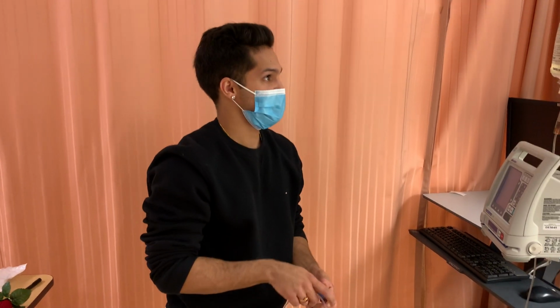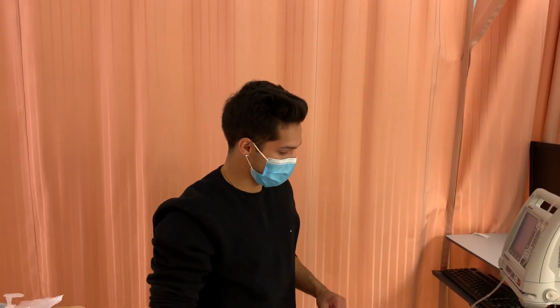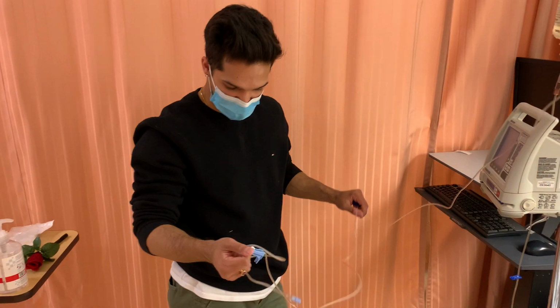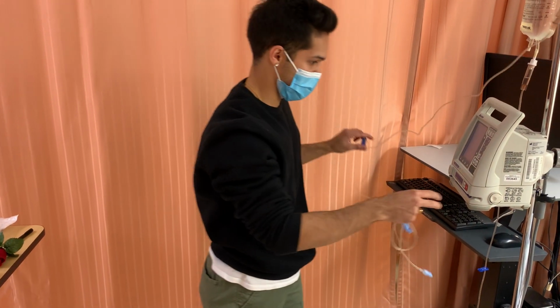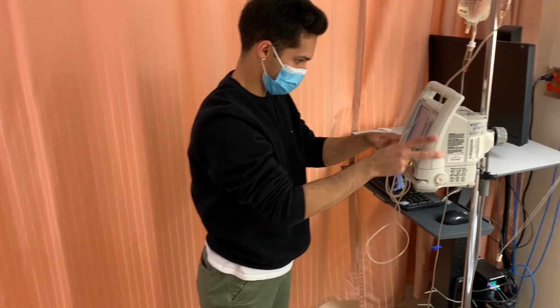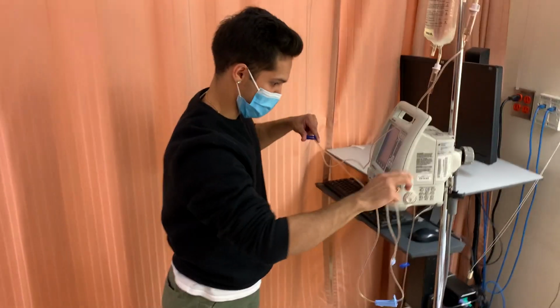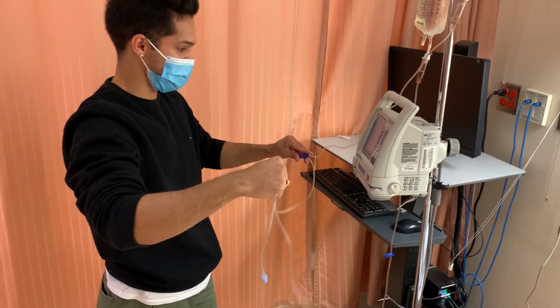I wasted some medication right there, but that's fine, as these bags always come with extra medication. So now that the line is primed, there are no bubbles in the line. I'm just going to be opening my pump up before I attach it to my patient, because I don't want to accidentally bolus my patient.